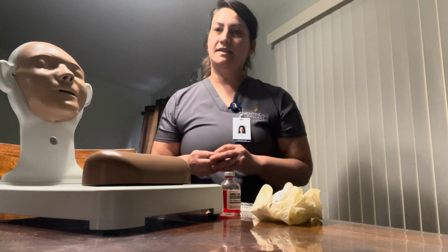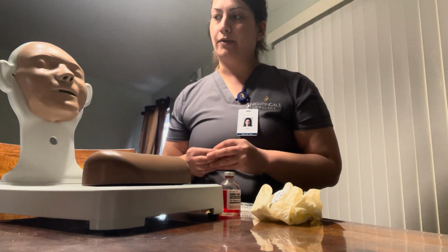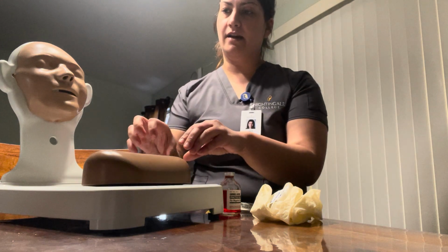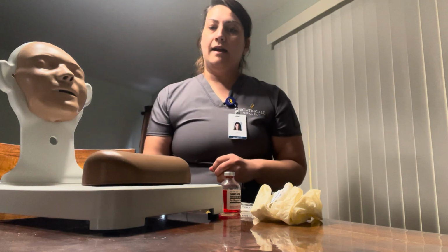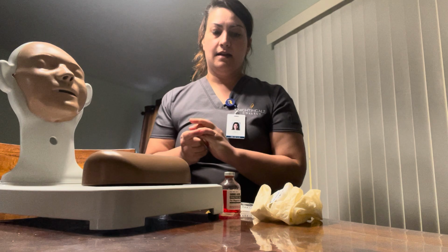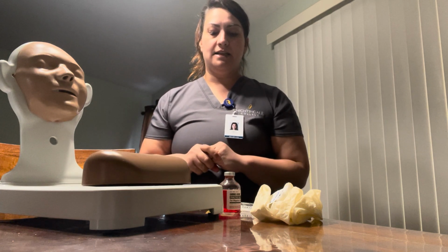Hi, Ms. Smith. My name is Olga. Today I will be your nurse. Can you please verify your date of birth, your first name, and your last name? All right, perfect. And I'm going to check my wristband for 2 patient identifications. All right, Ms. Smith. I'm going to wash my hands. And I will start with the procedure.